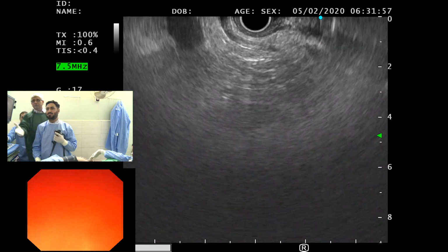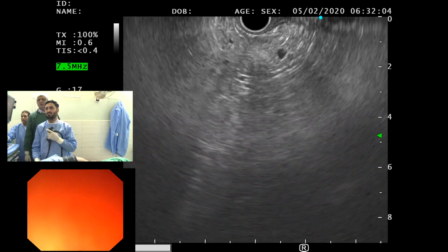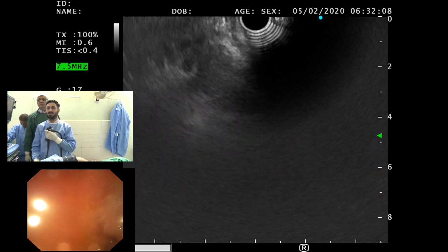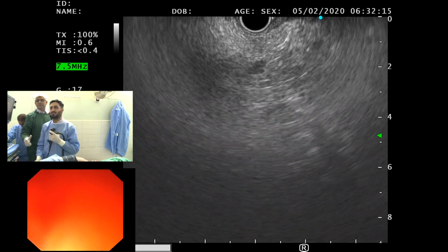Now, you need to bring the CBD because I want to see what's happening here. Have you fallen back into the stomach? I have a feeling you might have. Yeah. Okay, the tip up, please. Okay, I need now, doctor, please give it to me, let me see, I have to do the FNA.